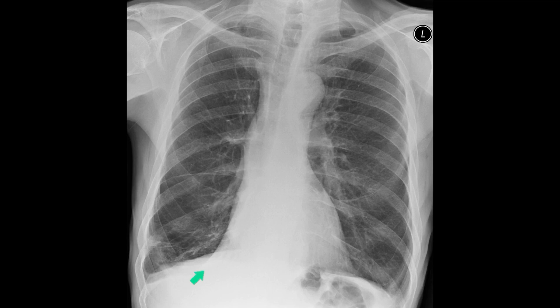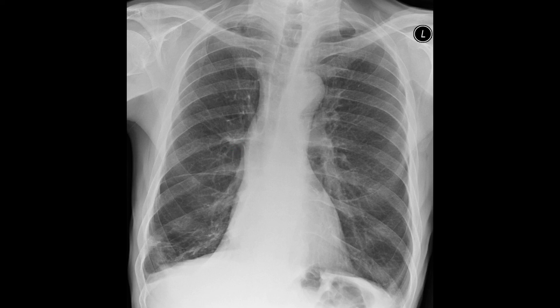Here is another example of a right lower lobe collapse. Here is the interface of the collapsed right lower lobe, and just here is the right heart border formed by the right atrium. Note that the right hilum has been pulled down and is difficult to see because it has been tucked inside the heart shadow.